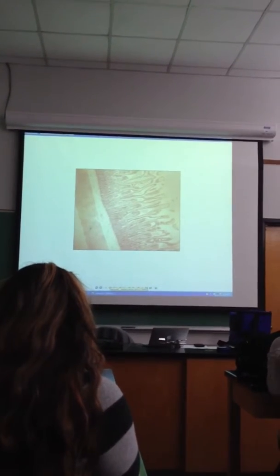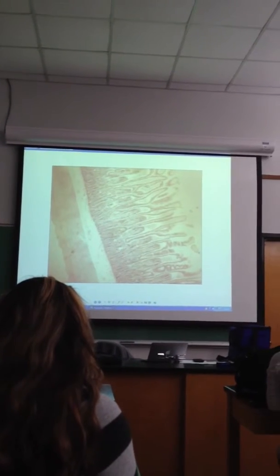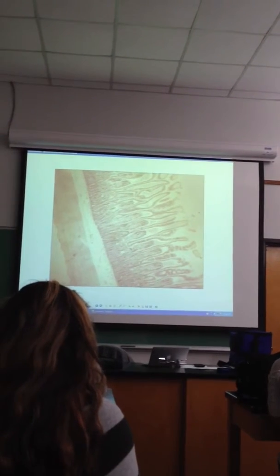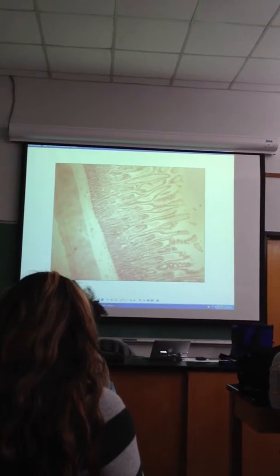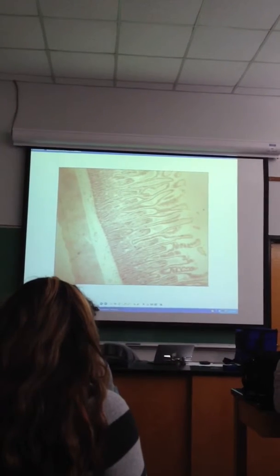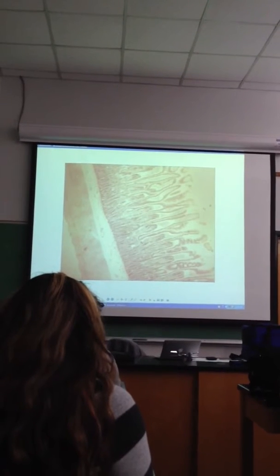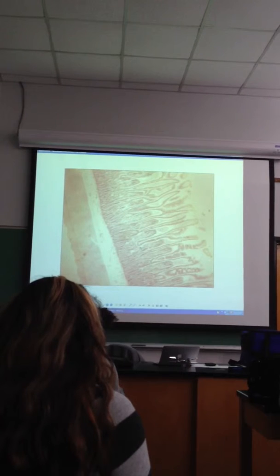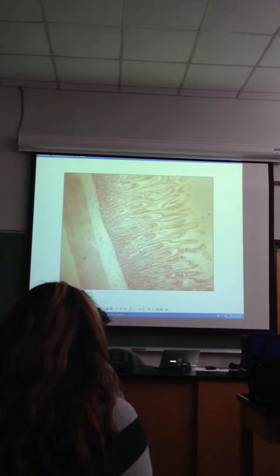This one here is actually at the jejunum. What you see in those long, slender projections, if you compare and contrast the two, you'll see that the stomach has these shorter indentations. Those are your gastric pits. They're not very deep at all. But within the small intestine here, these villi, the finger-like projections, are long and slender. And it makes these very long, narrow tunnels. They're not really called anything, they're just little depressions in between the villi, but those villi are distinctive of the small intestine. So, villi here, like through the jejunum.